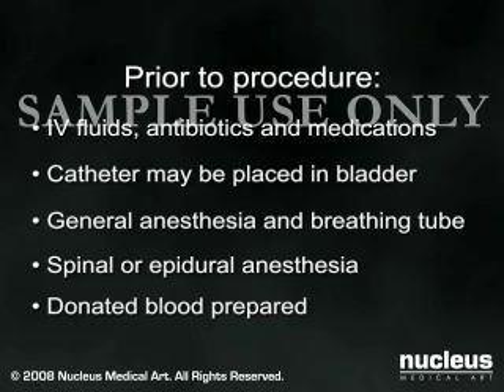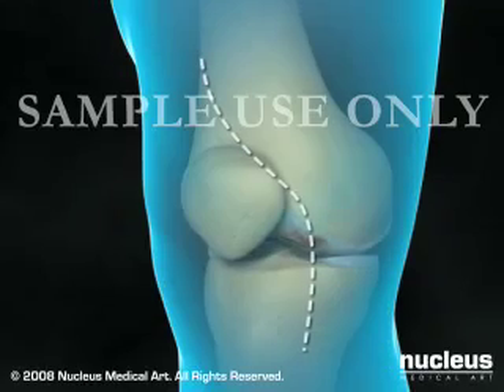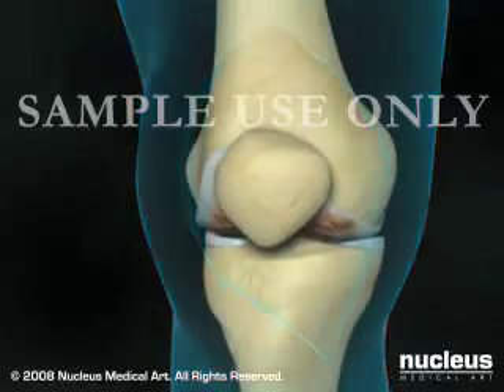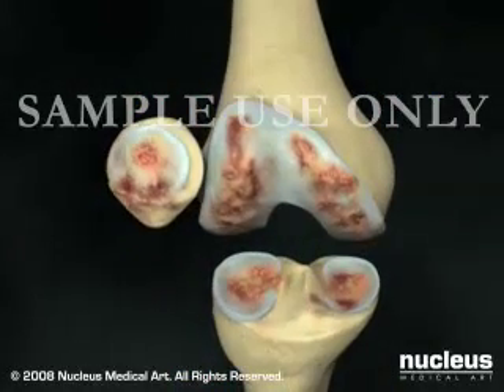Most total knee replacements take approximately two hours. Your surgeon will begin by making an incision along the front edge of your knee. After separating the muscles and ligaments around your knee, your surgeon will incise the knee capsule to gain access to the inside of the joint.